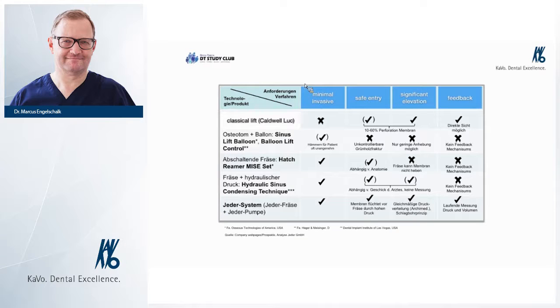Normally okay, but remember I told you never touch the sinus with an instrument, and if you look at this picture, well, it's quite difficult not to touch if you see the drill. And there's a new method working with high hydraulic pressure in combination with the burr to elevate the sinus floor augmentation.